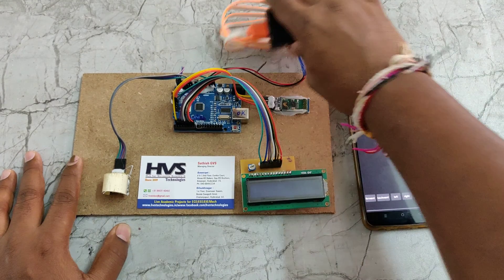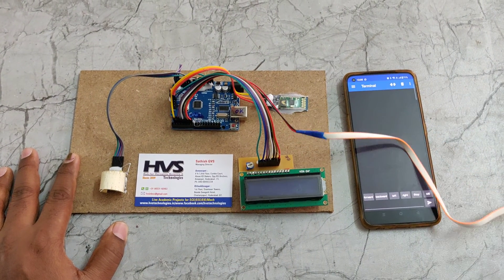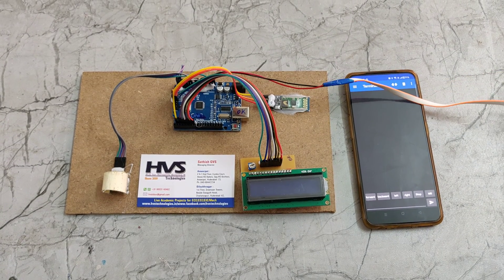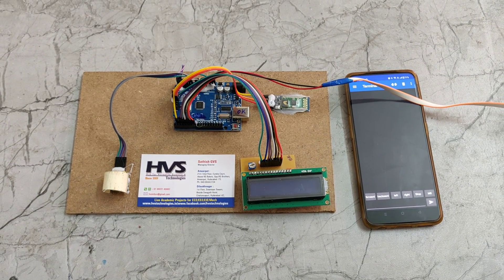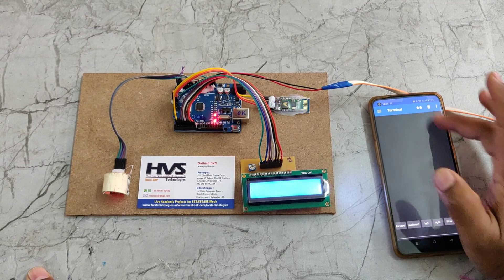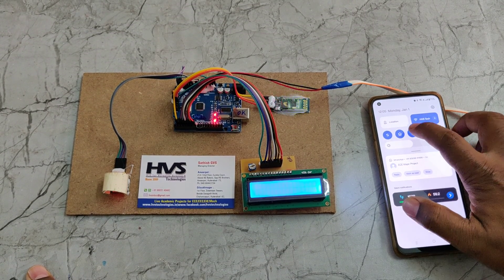After installing the application, apply power supply to the kit. First, you need to pair the HC05 from your phone's Bluetooth settings.